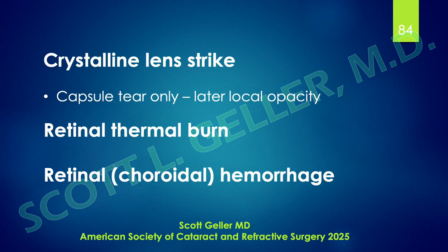And when you think about it, those of you who have had a lot of experience out there, you've seen patients that have had maybe a sharp pin or a small nail hit the lens of the eye, the natural lens, and they have an opacity where this disruption of the capsule was, but the rest of the lens is clear. So don't panic too much. Just maybe tell the patient if they ever need cataract surgery to have the surgeon really look carefully at the lens of the eye and be careful when he does his phacoemulsification.